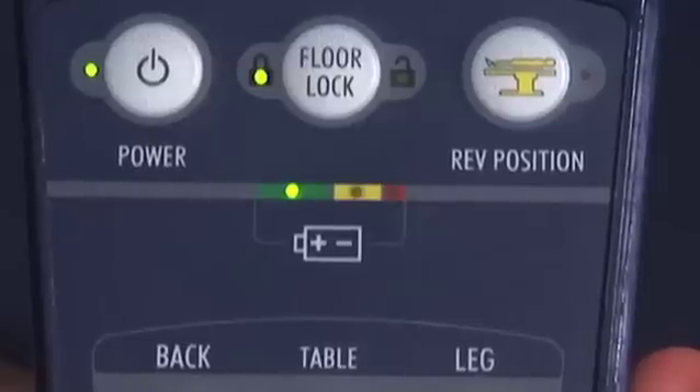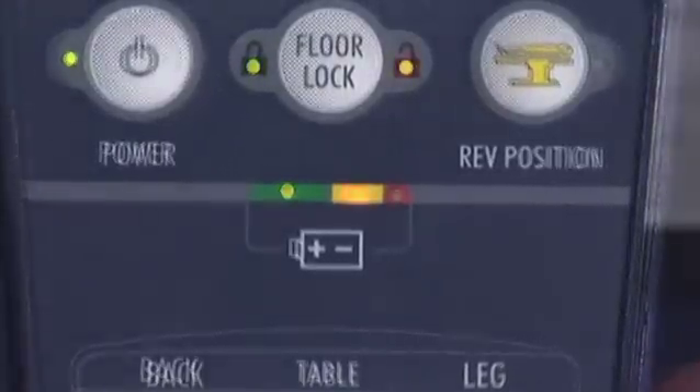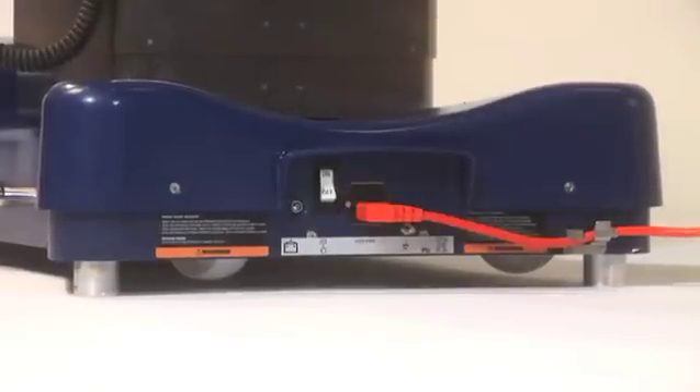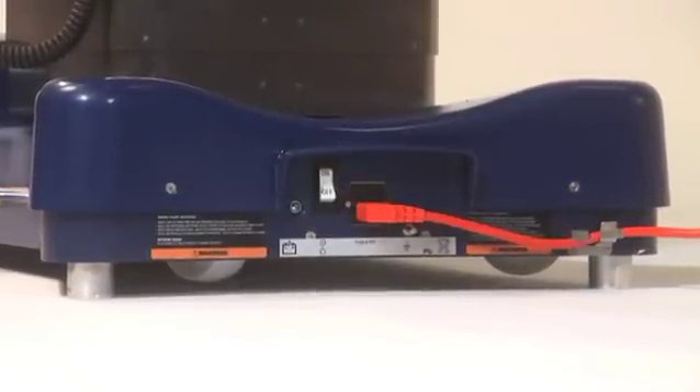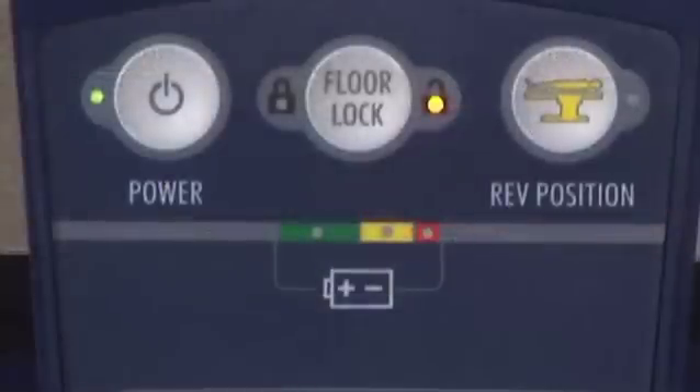When fully to medium charged, the light will be green. When the battery charge is low, the light will illuminate yellow. The table will continue to function normally, but should be plugged in at the first convenient opportunity. When the red indicator is illuminated, the table must be plugged in to operate.